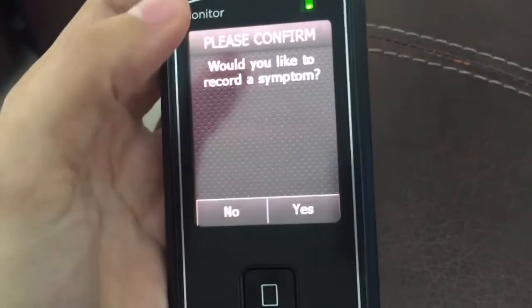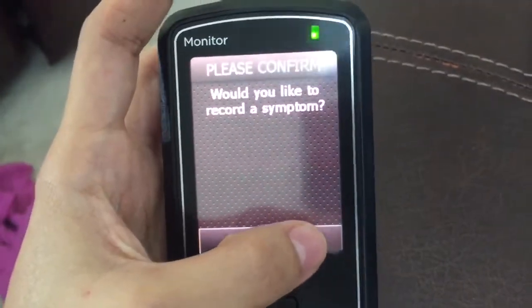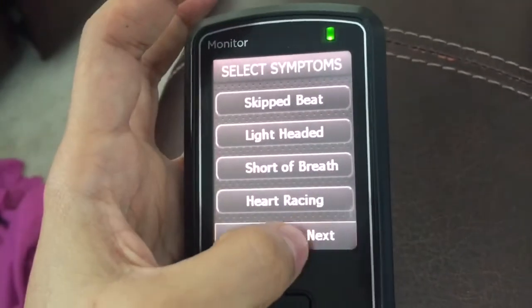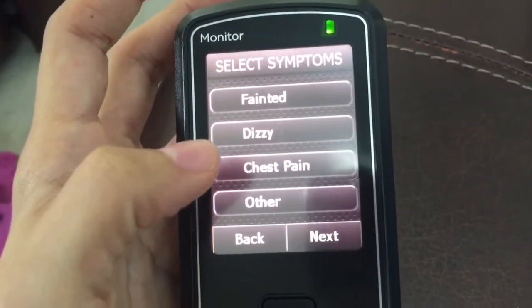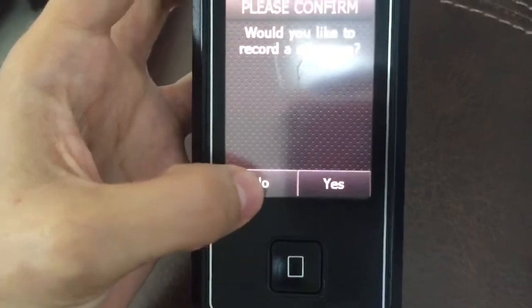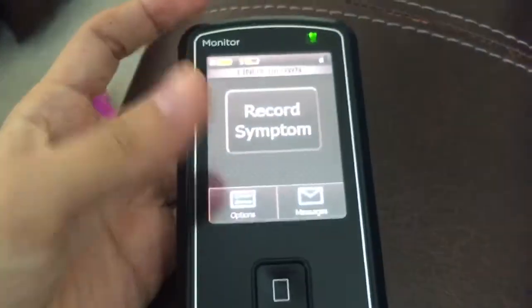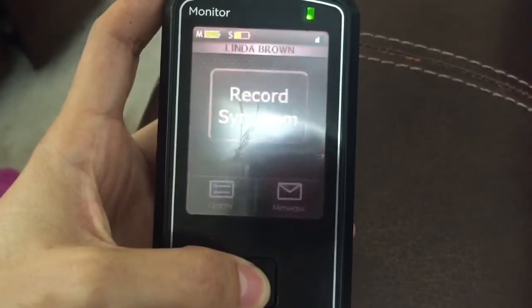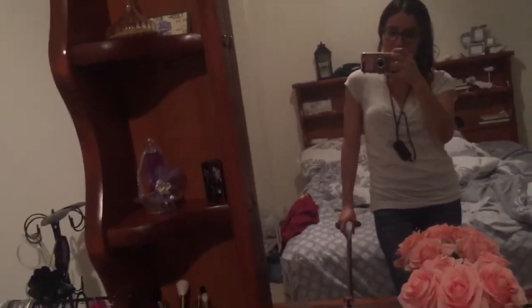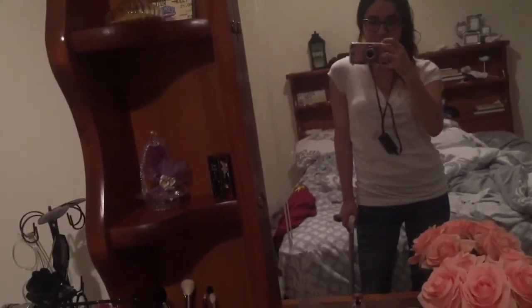I'll click over here to show the symptom recording — I can select options like lightheaded, shortness of breath, heart racing, fainted, dizzy, chest pain, and other. But I don't have any symptoms so I'm not going to record anything. I'm putting the device to sleep — it's still on but in sleep mode. That's it, I'm ready to go. This is my Holter monitor routine. Hope you find this useful if you're about to use one or got prescribed one. Good luck!